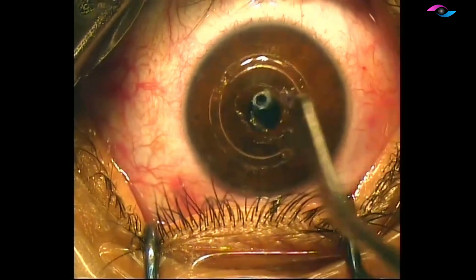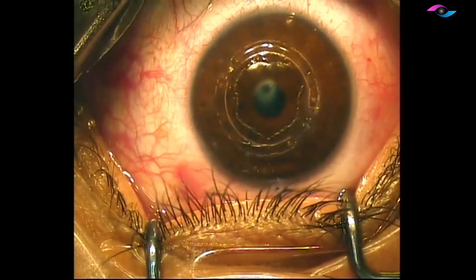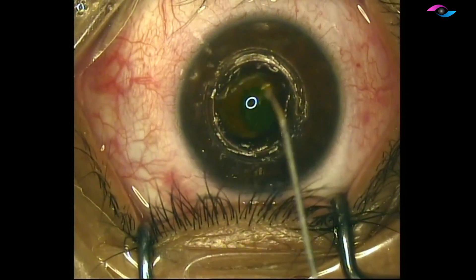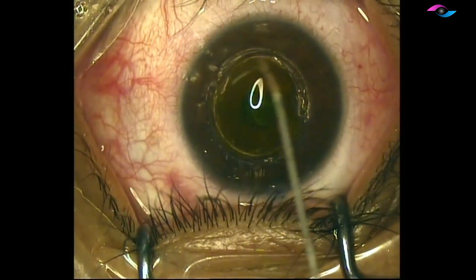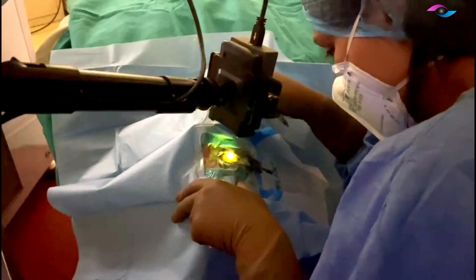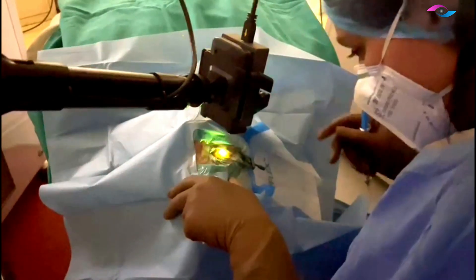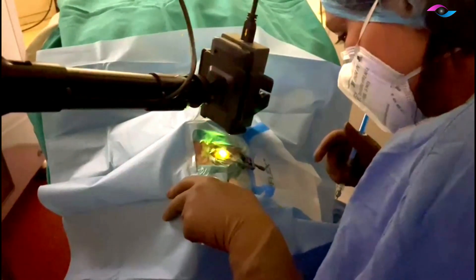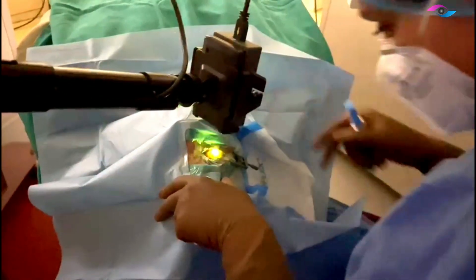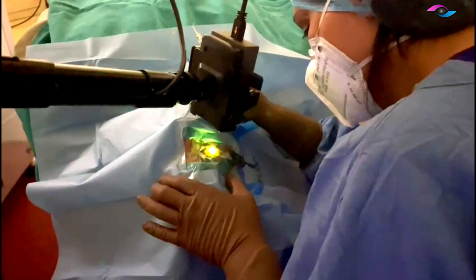We are now going ahead with collagen cross-linking as well, so we have combined C3R and INTACS for this patient since he has progressive keratoconus. After debriding the epithelium in the center only — not over the INTACS — we have placed riboflavin. The cornea is pre-soaked for about 20 minutes, with riboflavin drops instilled every two minutes. This is the accelerated protocol using riboflavin in HPMC.